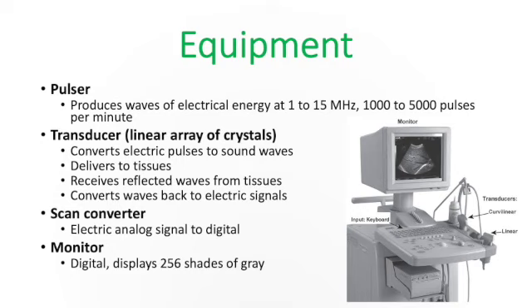We're used to ultrasound being at 1 megahertz up to about 3.3 megahertz. With diagnostic ultrasound, we're actually going to go up to 15 megahertz, and in some cases 21 or 22 megahertz depending on the machine. So we actually are going to use a lot higher frequency ultrasound because we're going to do a very different sort of ultrasound than what we're used to.